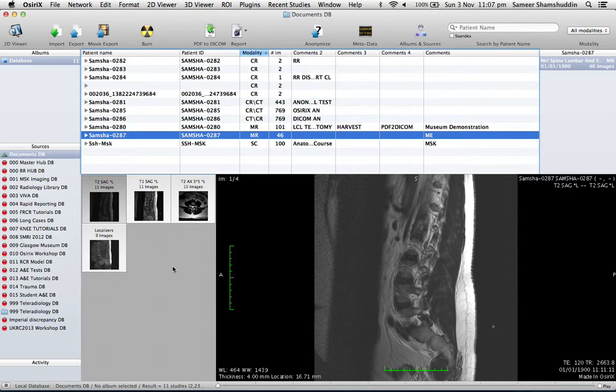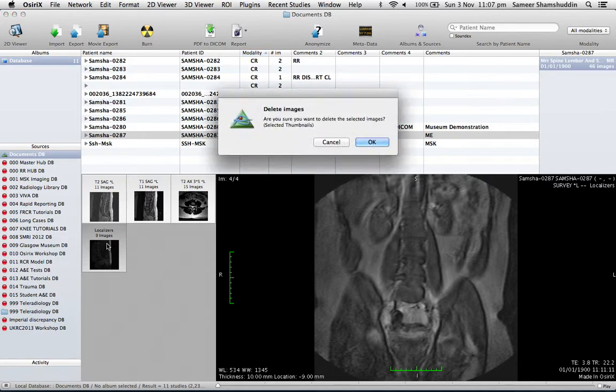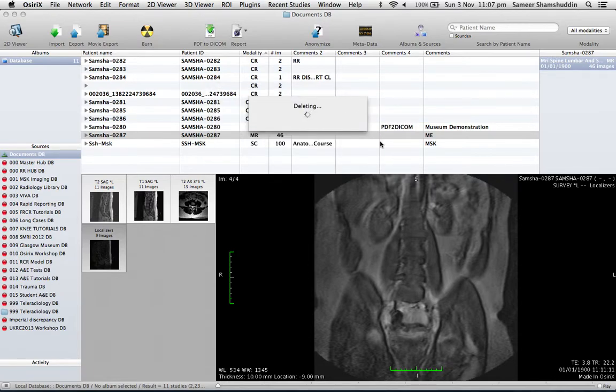I do not want the localizers, so what I would do is select the localizer by clicking on that particular series and hit backspace, which will prompt me to say 'Do you want to delete these images?' Just click yes.